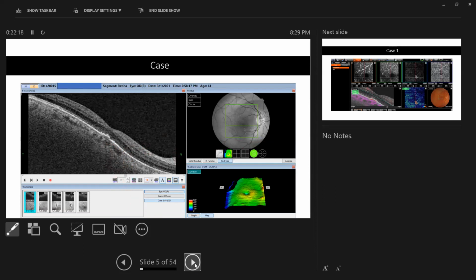About the vascularized drusen, one of the slides, you talked about the vascularized drusen and the prognosis in AMD. It means there is a high probability of getting macular neovascularization. No, you just observe.